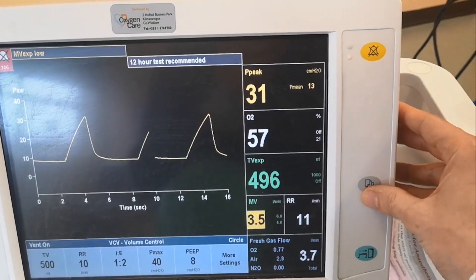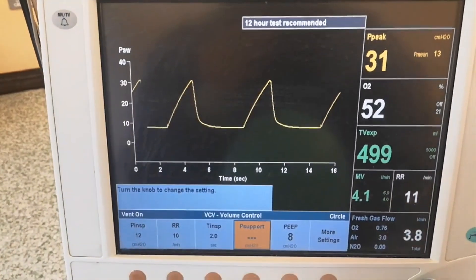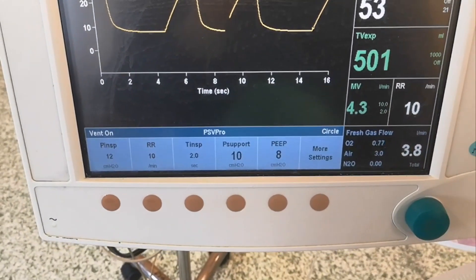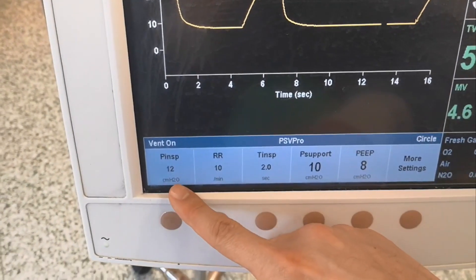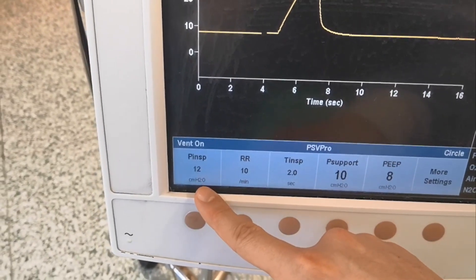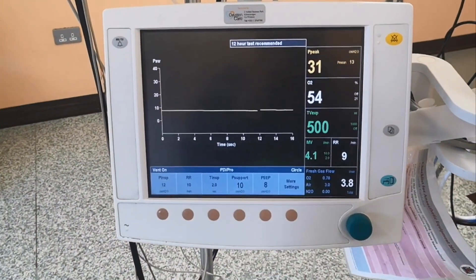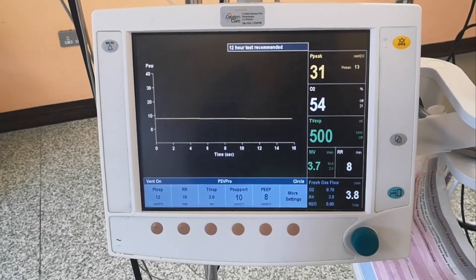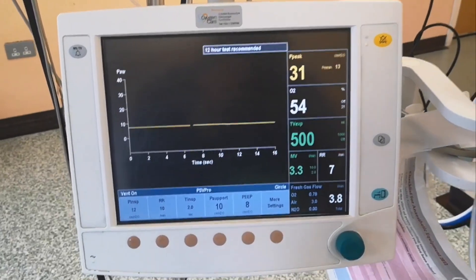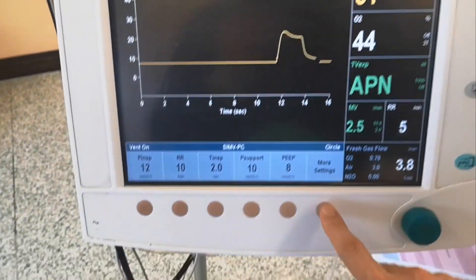If you want to set PSV Pro mode, go back to ventilation mode and select PSV Pro. It immediately asks which pressure support you want — let's say 10. You also have a backup rate and backup pressure. Since there's no patient triggering here, after about 30 seconds you'll see it switch to backup mode. There we go — the backup mode is now active with these settings.